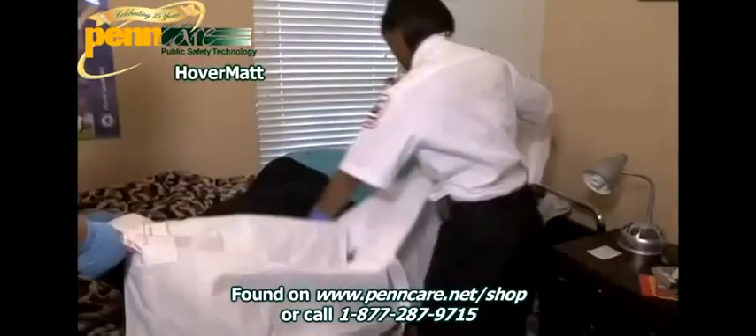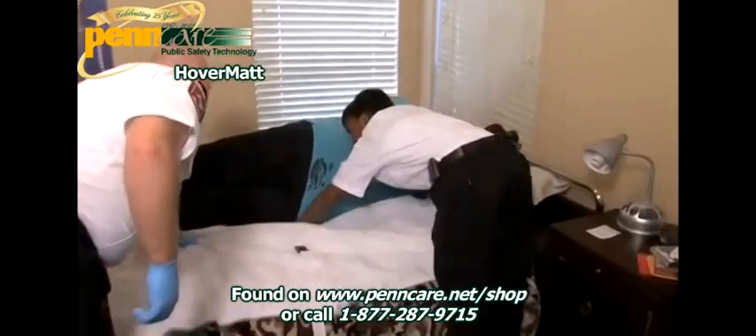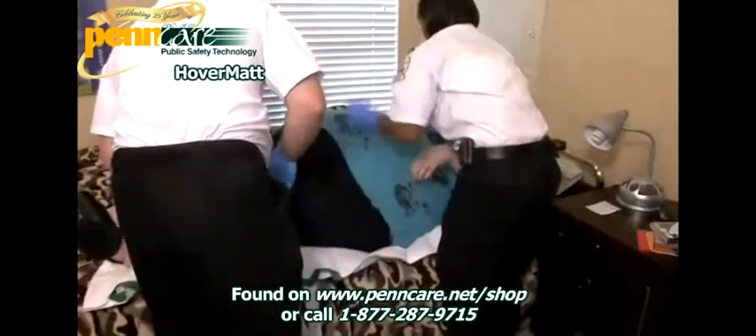Now that your patient has been lifted to the appropriate height, how would you safely transfer them? PennCare's solution: the Hovermat.